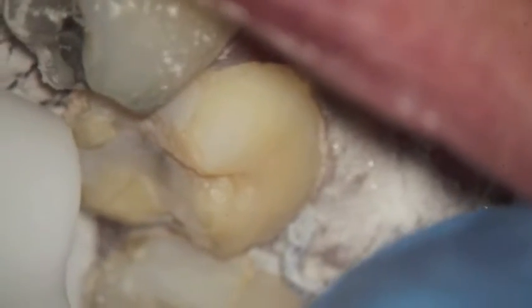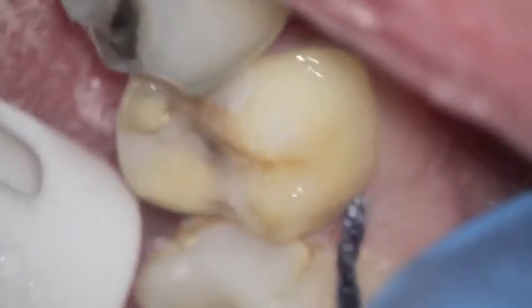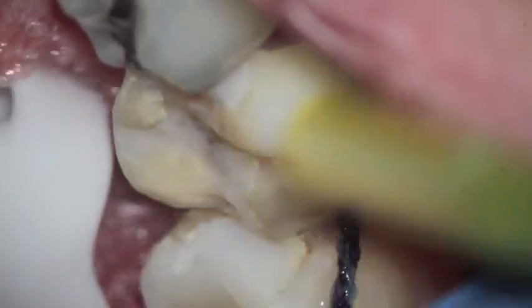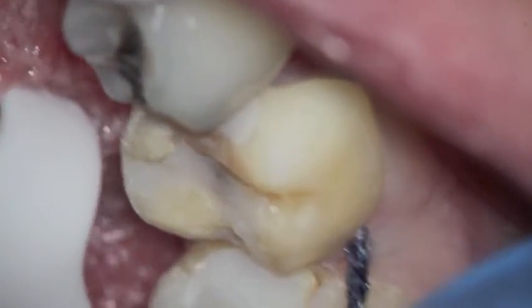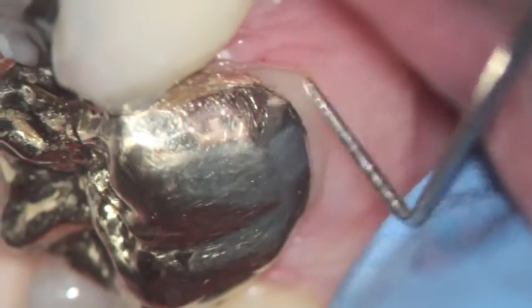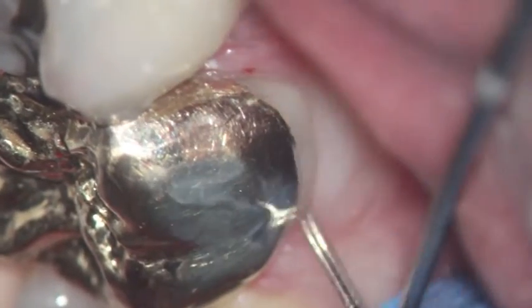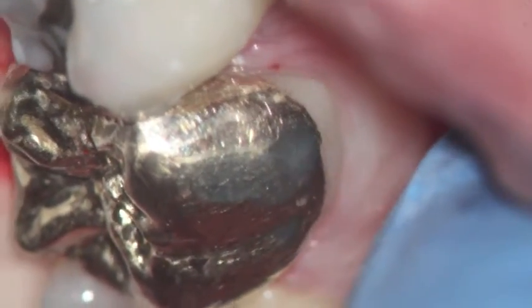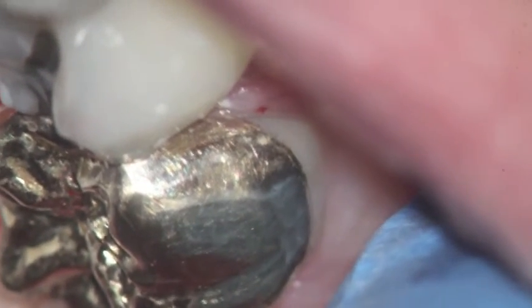You can also see that I've been removing the cement from the temporary with a micro etcher, and the white powder that I just rinsed off was the aluminum oxide from the white etcher. You can see how clean the tooth is, and that's a piece of cord that was around the tooth to allow me to do a nice job of removing the cement without causing the tissue to bleed.